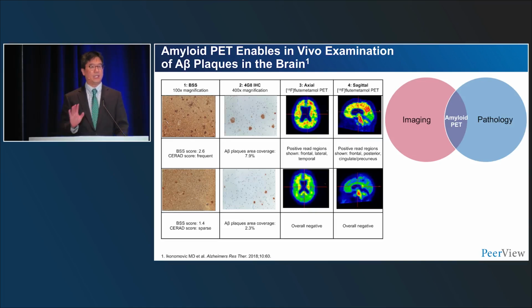Inherently very, very different. Okay? FDG PET is our classic nuclear medicine exam that's really functional. How we distinguished ourselves from the rest of radiology, which is anatomic, nuclear medicine is functional. This is sort of the next generation of where nuclear medicine has gone. We're now molecular. Just like if you talk to pathologists now, there's molecular pathology. This is why the Society of Nuclear Medicine changed its name to the Society of Nuclear Medicine and Molecular Imaging.